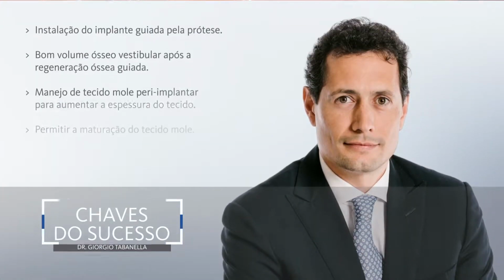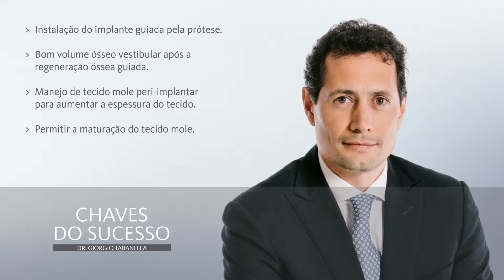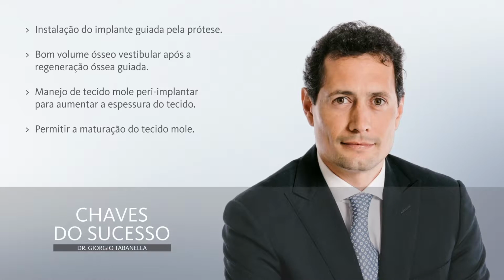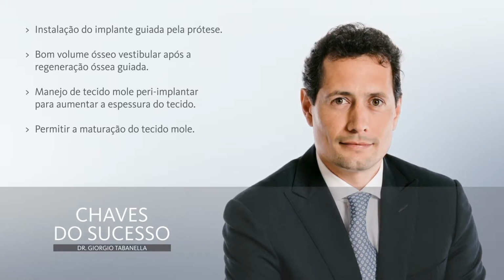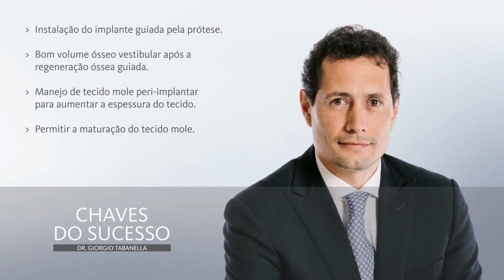Well, so which are the key points here? First of all, we need to insert the implant in the prosthetic-driven direction. Then, of course, we need to have a good thickness of the buccal bone balcony. And then, of course, we need to manage properly the soft tissue, which will create a perfect sealing around the neck of our implant.